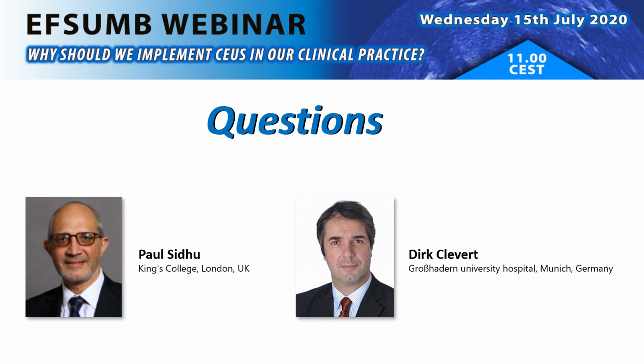Yeah, and I think the important take-home point is that it's a practical problem-solving tool. I know that in the EVARs that you've been doing, I think you've told me once that you actually did a whole EVAR under contrast-enhanced ultrasound guidance. Is this correct? That's correct. In the operating theater, yeah. So this was very useful because if the patient has renal failure or renal impairment, you're not subjecting them to a large amount of iodinated contrast. But it's not the first thing that our audience should start with, for sure.